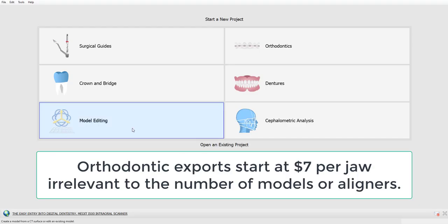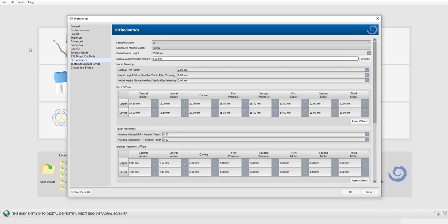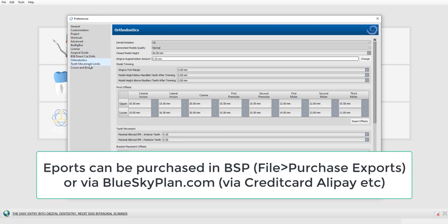This is Michael Saltzman from BlueSkyBio. I wanted to create this video to explain some of the options and preferences we have with our ortho module — specifically the preferences accessible from the tools drop-down for orthodontics and tooth movement limits.